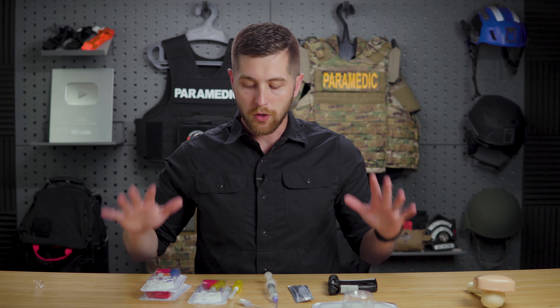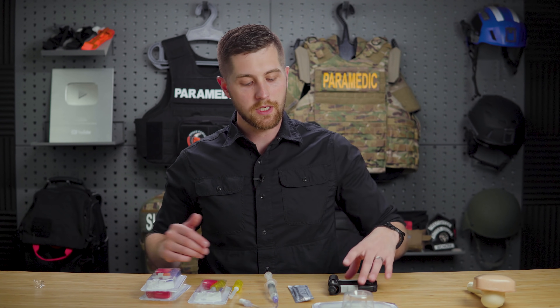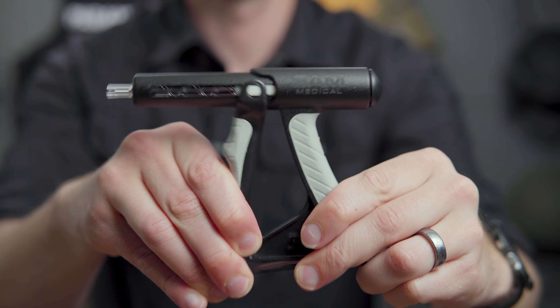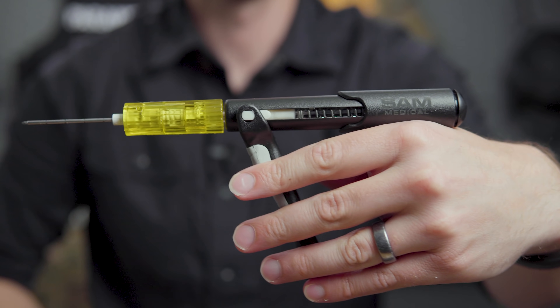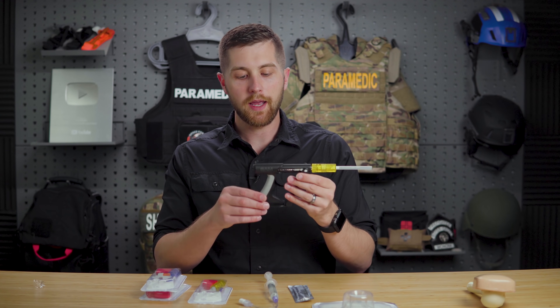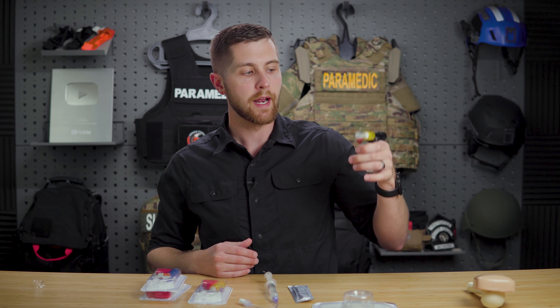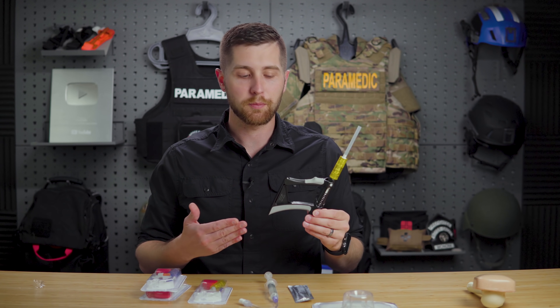Let's talk about the equipment you need to start an IO. First and foremost, you need a driver and a needle set. A driver is basically a drill — it allows you to spin the needle and apply downward pressure evenly to insert the needle into the bone. The one I have here is the SAM Medical IO driver. I like it because it is not electronic, doesn't run out of batteries, and gives you a tactile feel as you insert it.